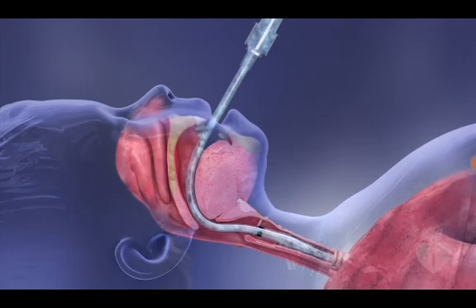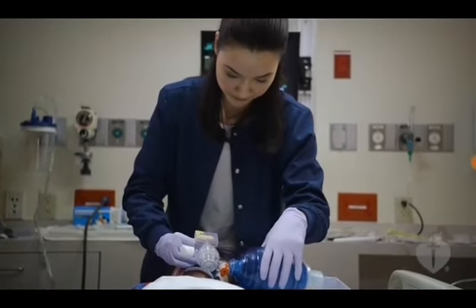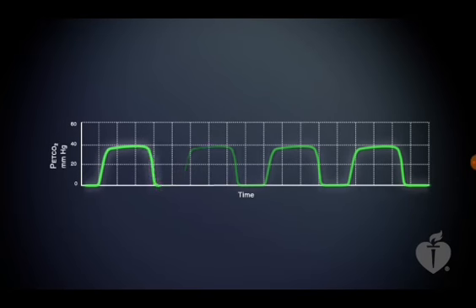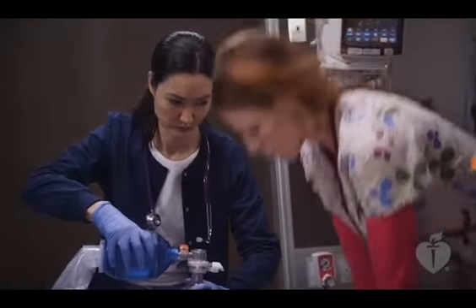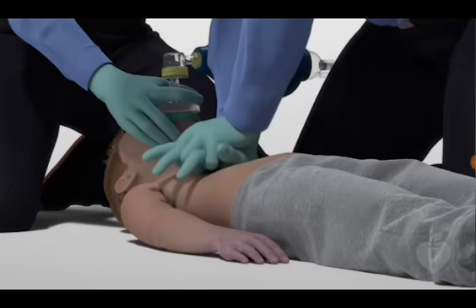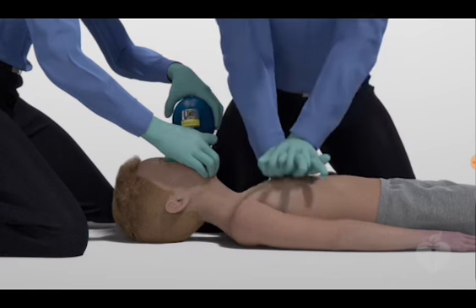Once the endotracheal tube is in place, inflate the cuff. Verify CO2 is present in the exhaled gas, either with a colorimetric CO2 detector or waveform capnograph to confirm proper tube placement. In cardiac arrest, CO2 may not be detectable. During cardiac arrest, the exhaled CO2 will be very low or undetectable because blood flow to the lungs ceases. If the exhaled CO2 remains very low during CPR, providers should attempt to optimize CPR quality, especially compression rate, depth, and minimizing interruptions. This can cause a rise in the exhaled CO2.